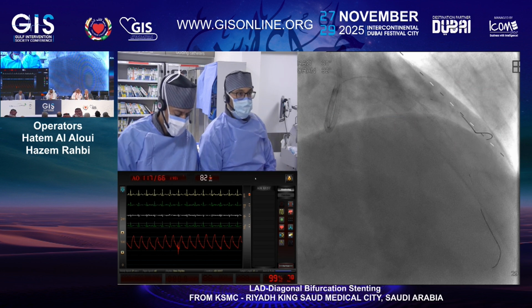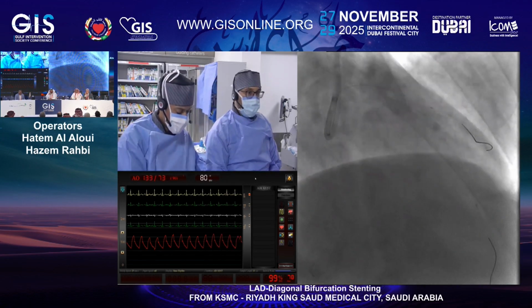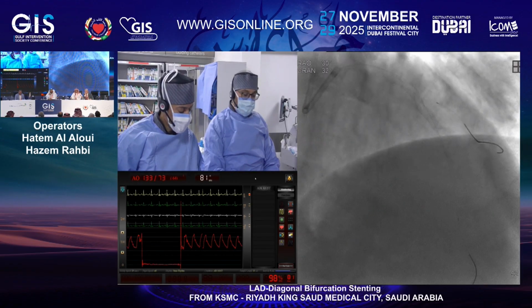So let's ask the audience, show of hands. Who would have used a longer stent back to the ostium? Who would use the same strategy, shorter stent only? So the majority favors your strategy of using a shorter stent.